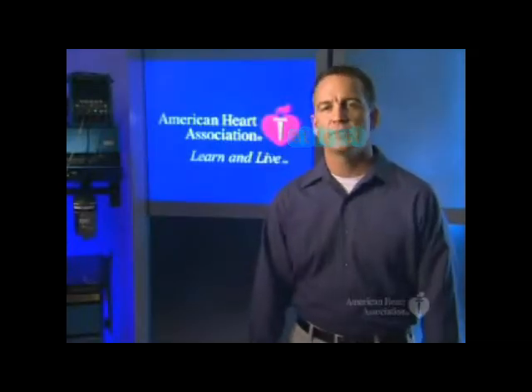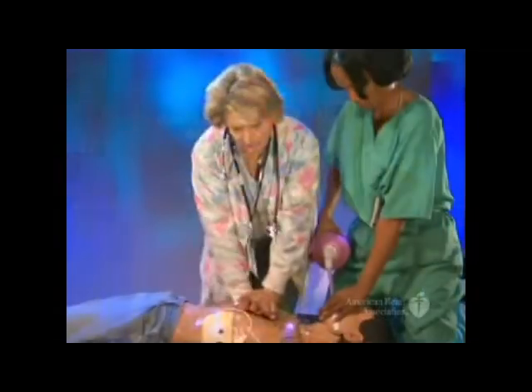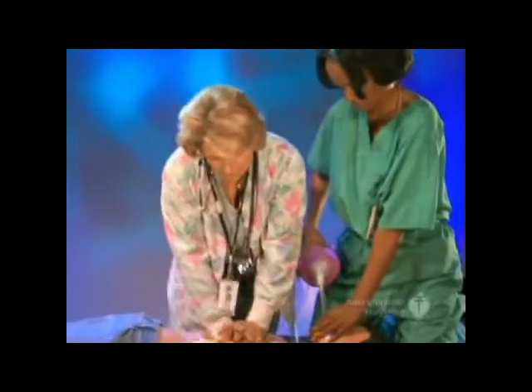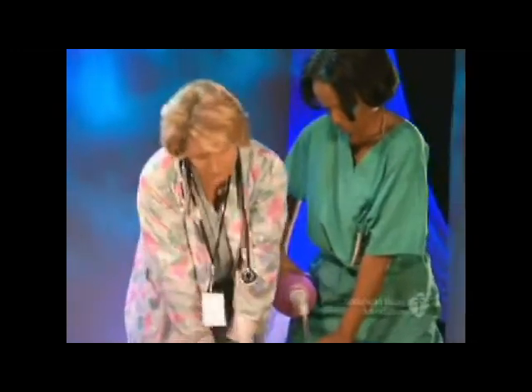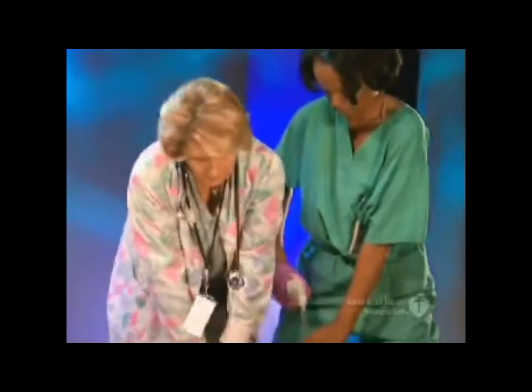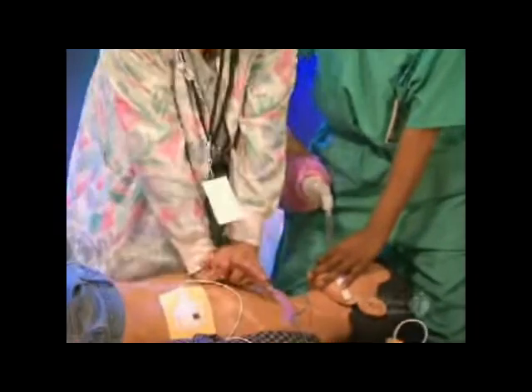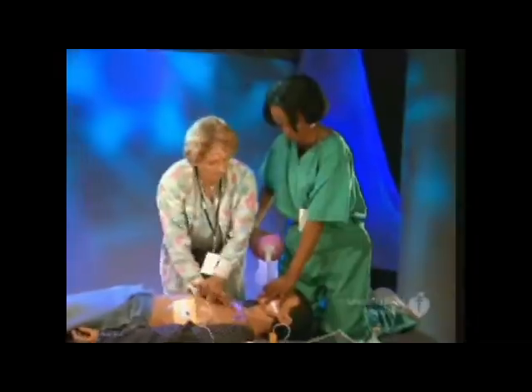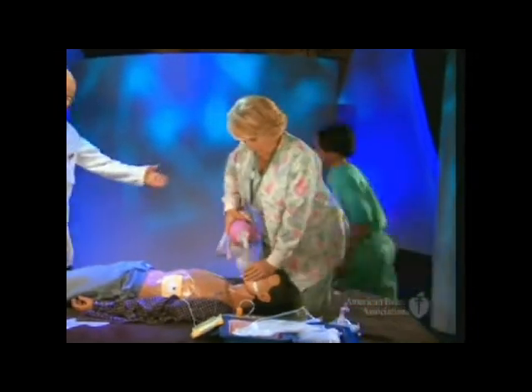The following scene in progress demonstrates the differences when performing CPR on a victim with an advanced airway in place. 9, 10, 11, 12, 13, 14, 15, 16, 17, 18, 19, 20, 21, 22, 23, 24, 25, 26, 27, 28, 29, 30. After 5 cycles of 2 rescuer CPR, rescuers should switch roles.